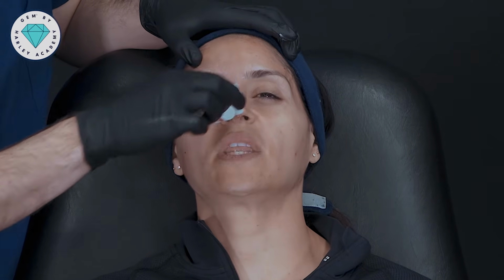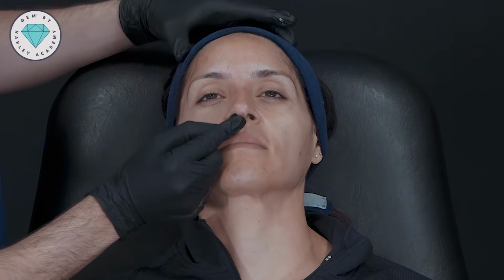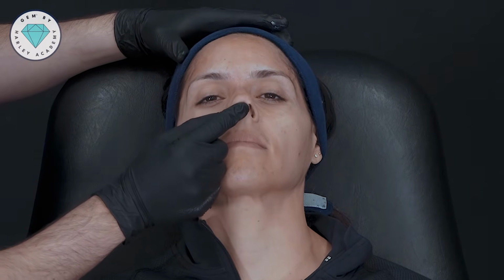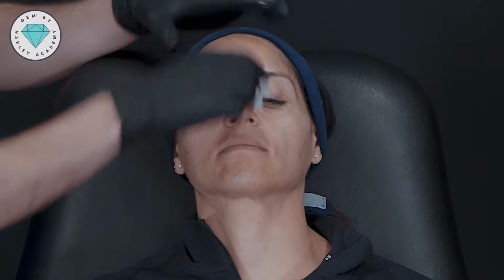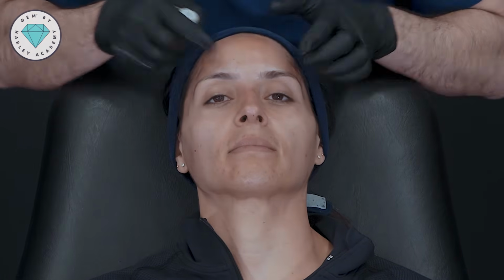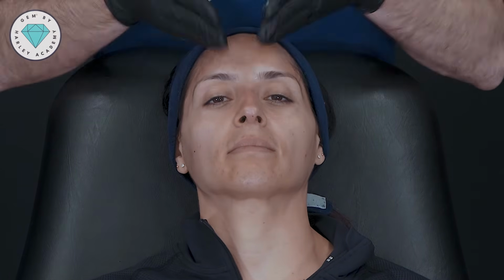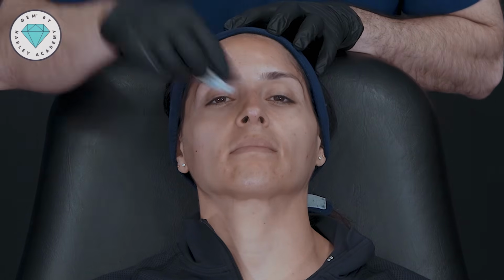Any pain at all? No, zero. Zero pain. Fantastic. And again, look, we've got this bleeding, and it's really important just to check the tip of the nose, the cap refill. Cap refill's immediate. So I think the nose is looking really pretty. Standing from the top, I see that I need a little bit extra here still. So I'm going to keep working on the nose before I show you the results.